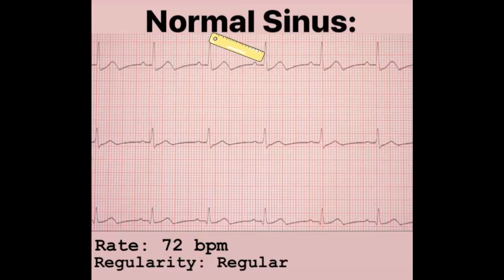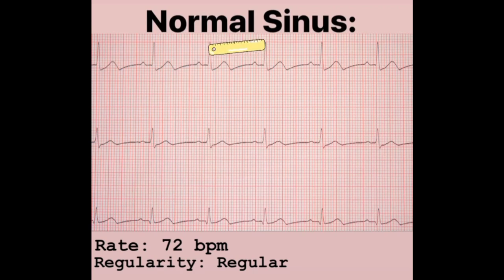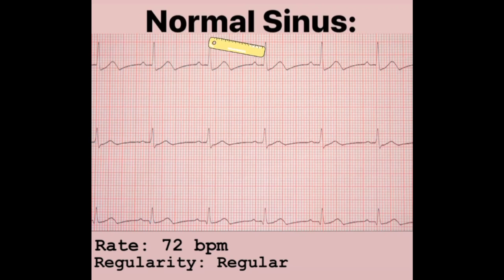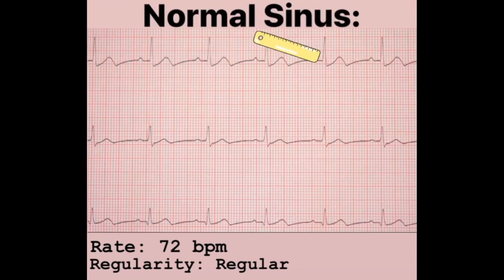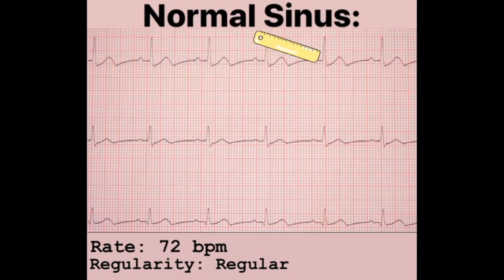The next thing we check is regularity. We're going to measure between our QRS complexes — and make sure you get a really scientific ruler like I have right here. They appear to be regular. Now we're going to measure between our P waves and they appear to also be regular. So that is off our checklist and we're on to the next.